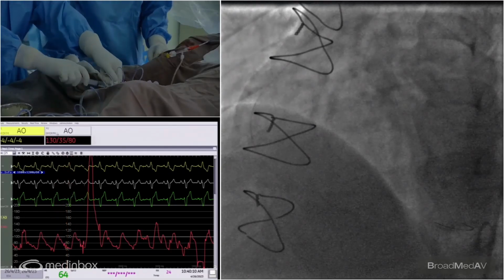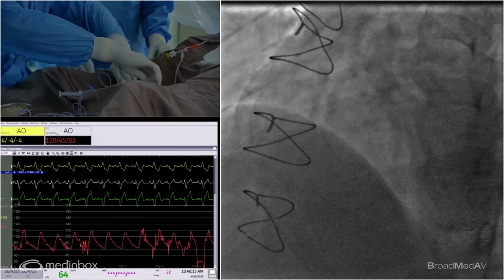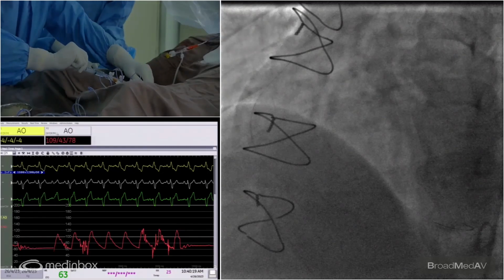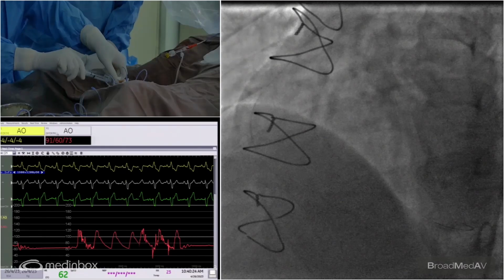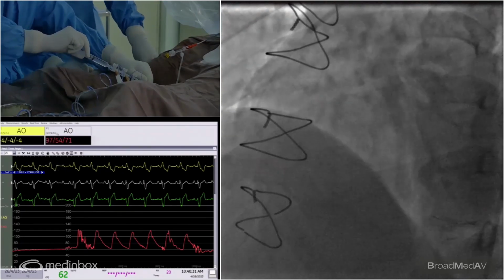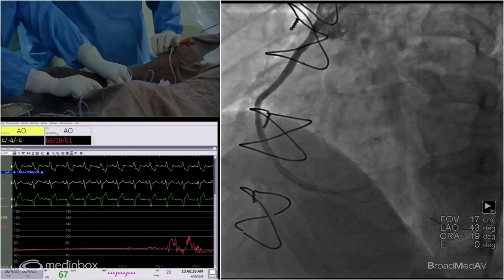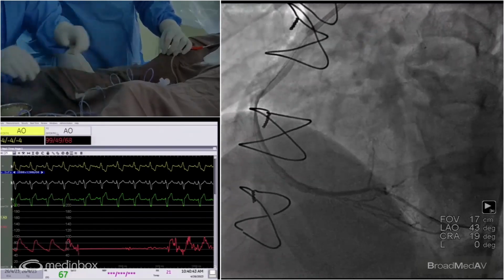Okay, let's give some nitroglycerin or nicorandil first and then take the IVUS in. Test cine, sir. All right. Okay. Yes, sir. Okay, it looks all right, but let me just do an IVUS to be sure we've done it. Okay, let's get the IVUS down, please.